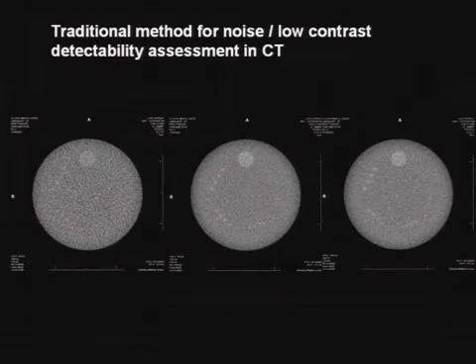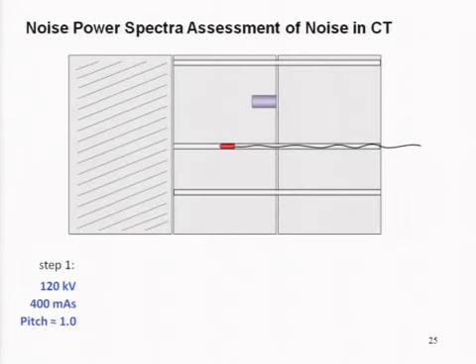So that was spatial resolution. What about noise or contrast resolution? And you're all familiar with low contrast detail phantoms. I've always thought that these were very subjective. And so the idea here is that we have this module, and let me run through that with you.